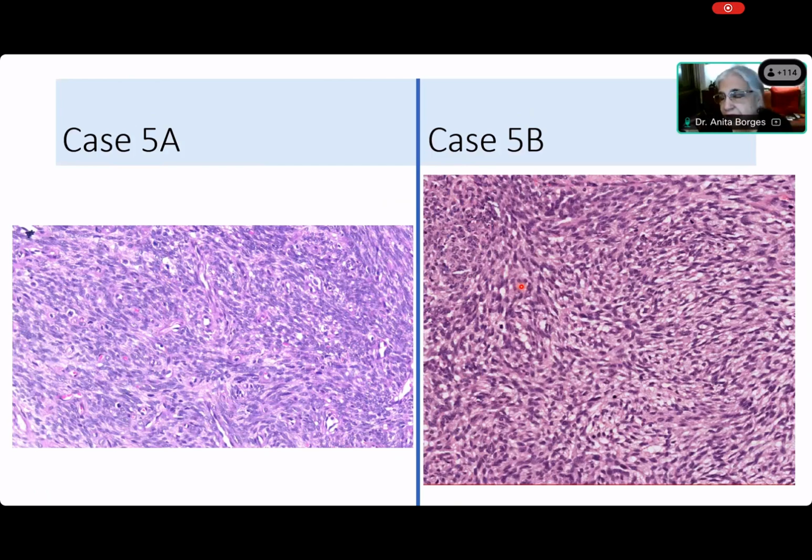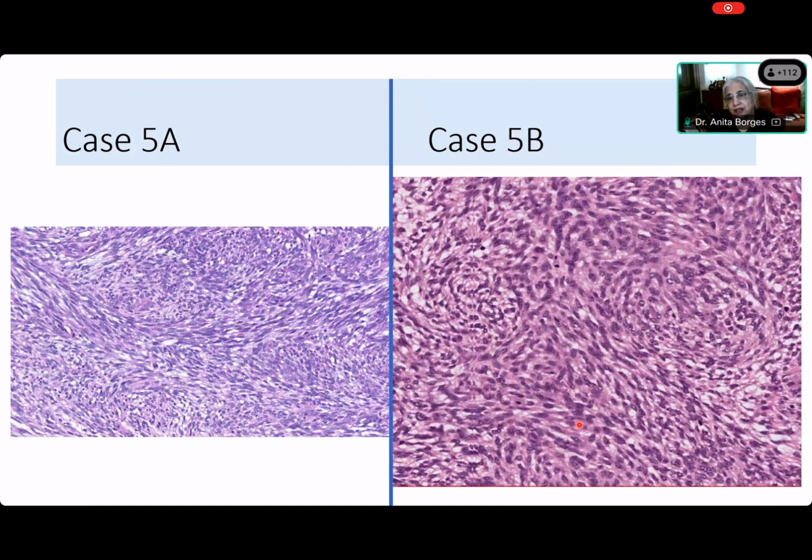Okay. So now tell me, we saw matrix in the neurofibroma. We saw matrix in the schwannoma. We saw matrix in the nodular fasciitis. Yes. Now tell me about the matrix over here. People have been forgetting the matrix. One is collagen matrix, in this collagen is eosinophilic matrix. In fact, there is hardly any matrix. They're such cellular tumors that there is hardly matrix. Look at it. There's a collagenized matrix. You know what collagen looks like.